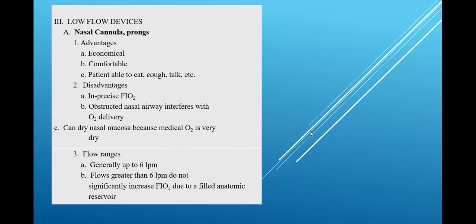Okay, so let's talk about some of the advantages and disadvantages of the nasal cannula. Nasal cannula, also known as prongs, the advantages: they're economical, comfortable. The patient can eat, talk, laugh, cough, etc. All right. The disadvantages is it's an imprecise FiO2. Can't guarantee its FiO2. Also, an obstructed nasal airway interferes with its O2 delivery.